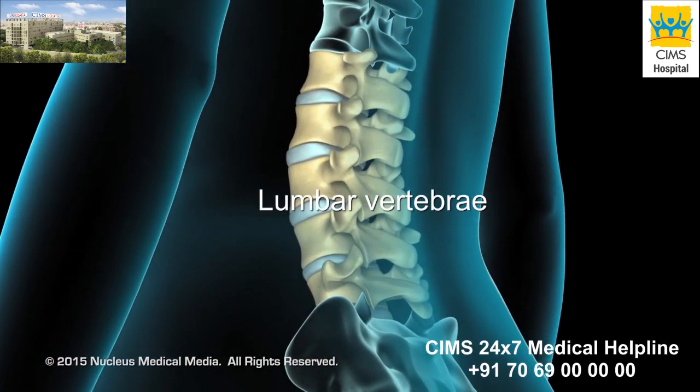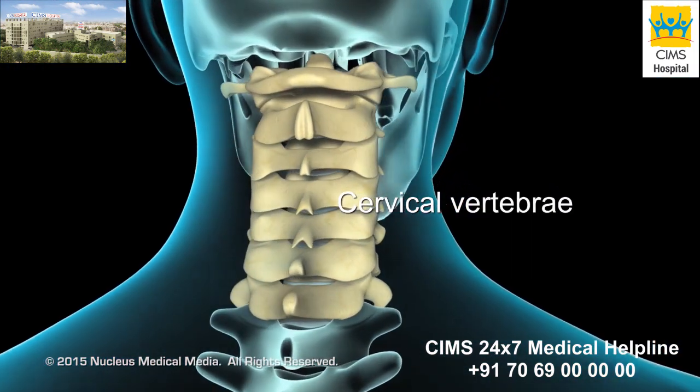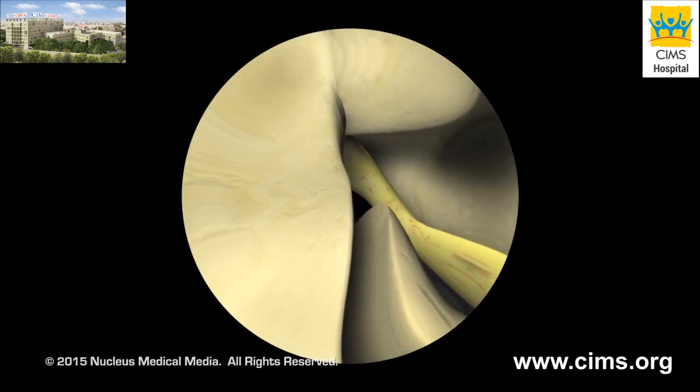A laminectomy can be done on a vertebra in the lower back, called the lumbar vertebrae, or those in the neck region, called cervical vertebrae. Microlaminectomy and microdiscectomy are procedures performed with the aid of a microscope.